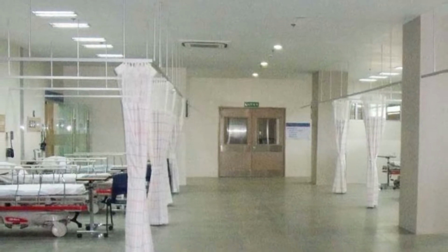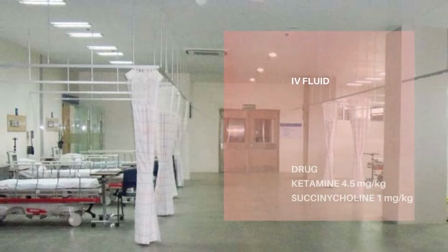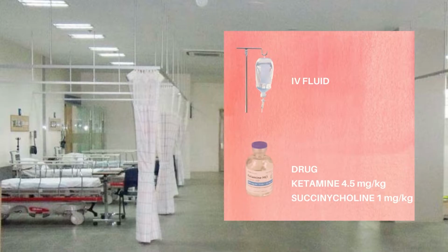So for this patient, she is already hypotensive, tachycardic, and also asthmatic. So the sedative given to this patient is ketamine 4.5 mg per kilogram via slow IV injection over 60 seconds. Prepare also a muscle relaxant, succinylcholine 1 mg per kilogram IV.